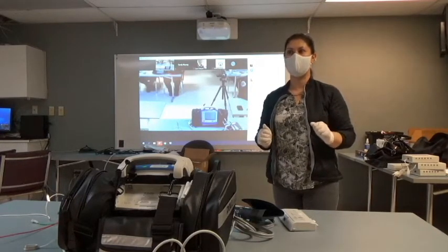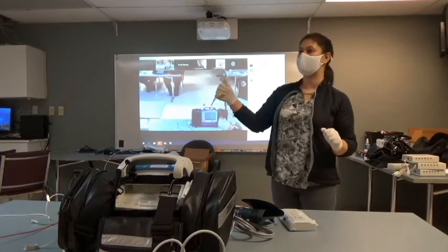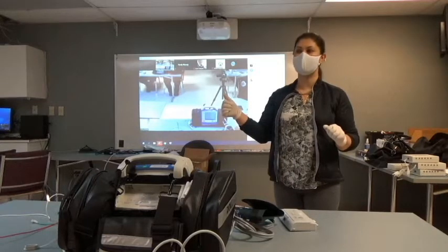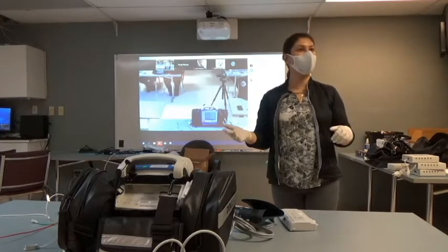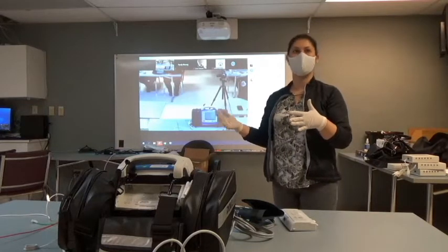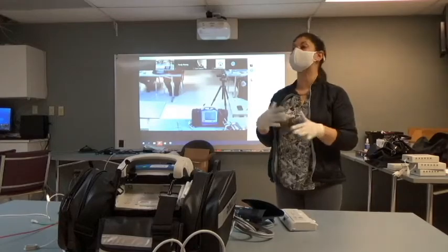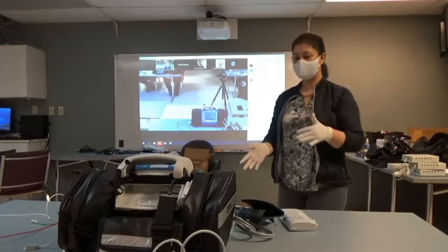Any questions about that? So the two takeaways from that, blood pressure on the inflation most of the time, pretty fast, in under 15 seconds. And then the other part is syncing to the R wave to help you get a more enhanced blood pressure reading if you guys are struggling. You don't need the four lead on to get the fast blood pressure. You just need to size the cuff up the right way.